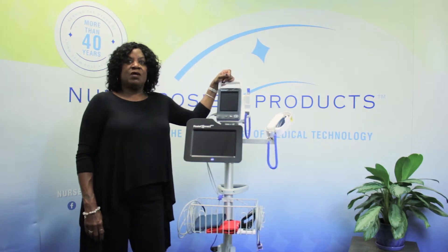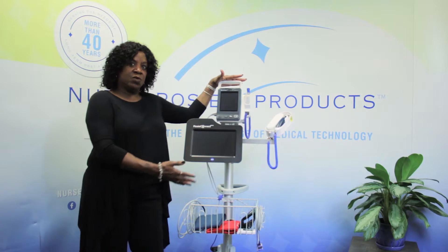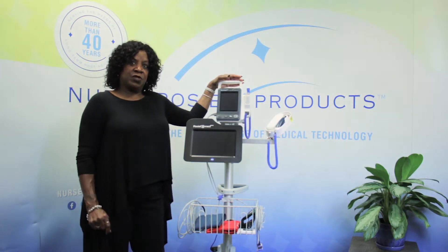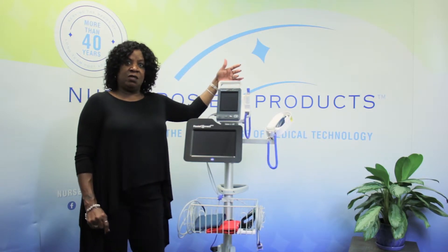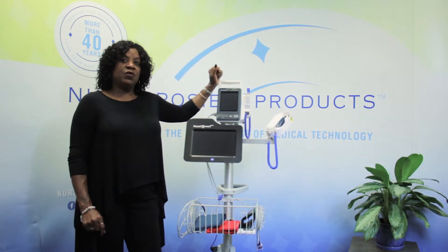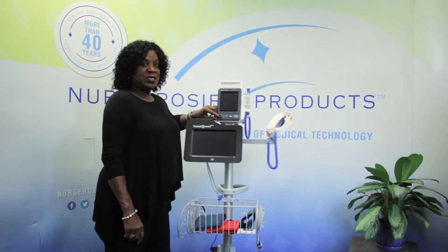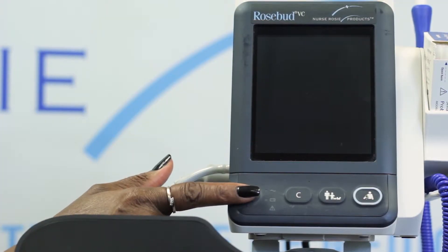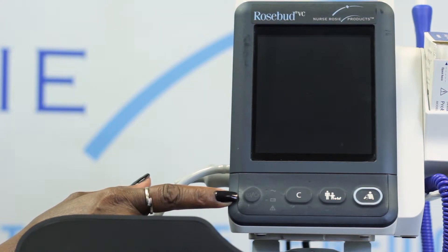Okay, great, let's begin. First I will show you how to power on the vital signs monitor as well as the RosyConnect 2.0 tablet. Let's do the vital signs monitor first. For today's demonstration purposes we are using the Rosebud VC vital signs monitor. If you're using the Rosy4 vital signs monitor, the process is very similar. As you can see, my finger is right over the button that has the on/off indicator. If the power switch is not lit at all, it's completely off.